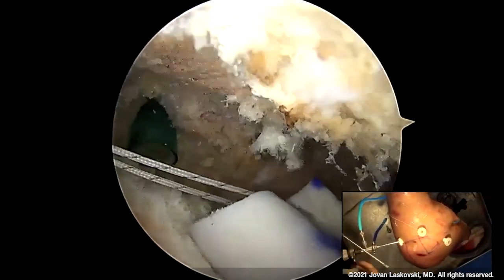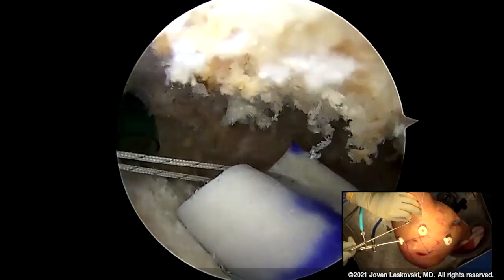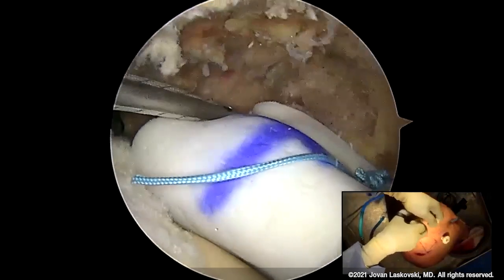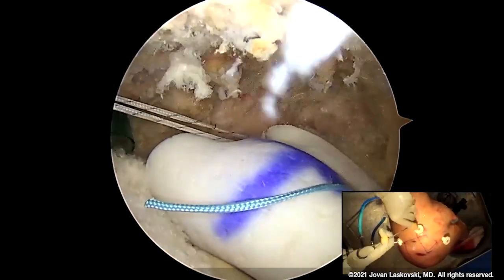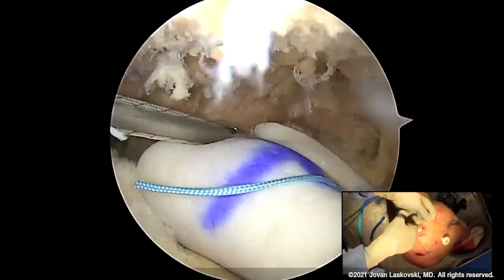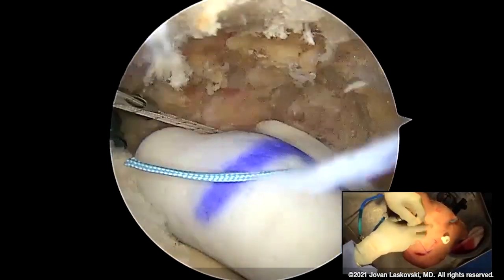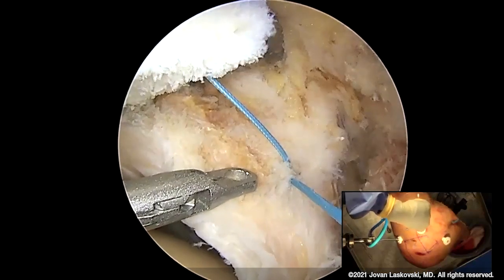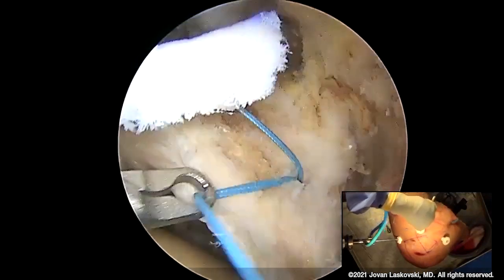Remember, acellular dermis is inherently stretchy — it has give and some play. I tend to like a line-to-line measurement for this. The reason I favor the 1.8 anchor is the strength profile: it's much higher than a 3.0 push-in anchor like we used back in the day. Their characteristics in both the glenoid and humeral footprints are ideal — they just work really well in that type of bone. We put these anchors a little more medial than some folks would; some place them right on the rim, but I want that bony contact of the graft.